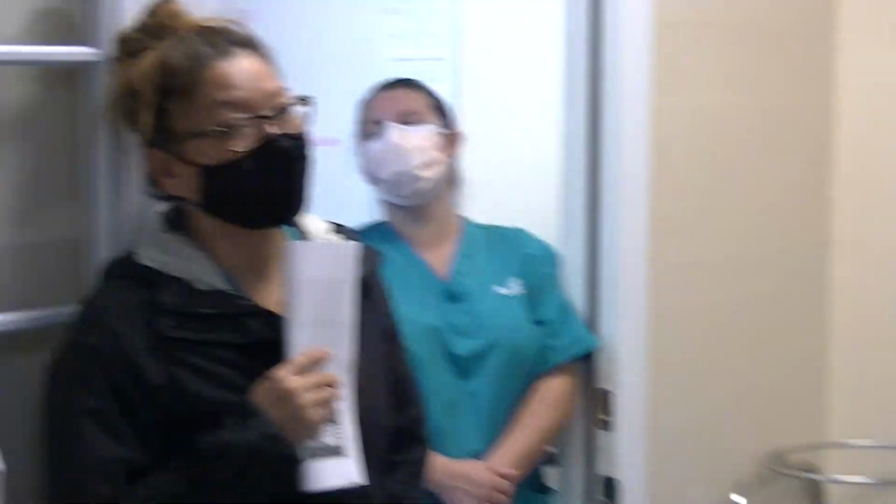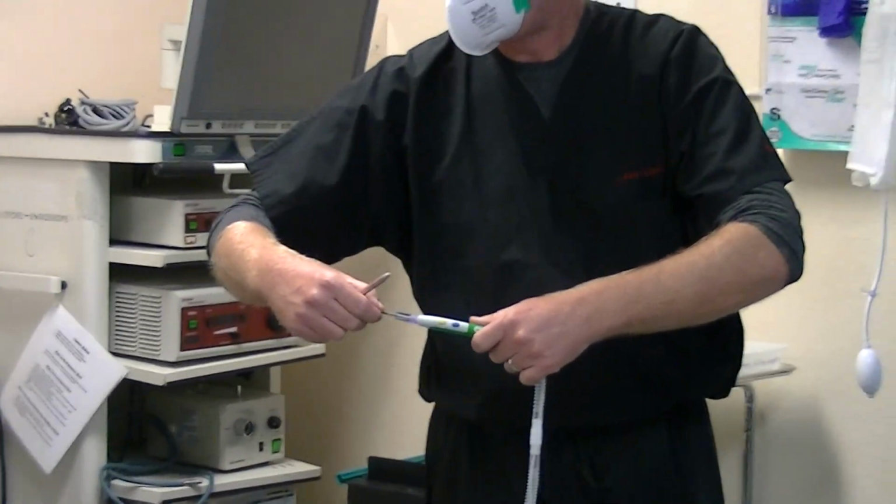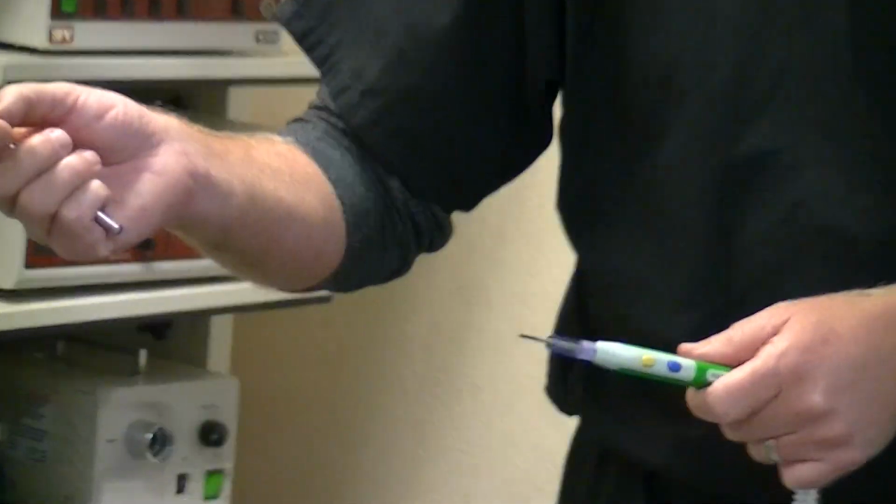So let's see, a good non-stick tip. This is a non-stick. With the non-stick, you can just use a wet sponge, or it just wipes off like Teflon. It's like cleaning your pan.